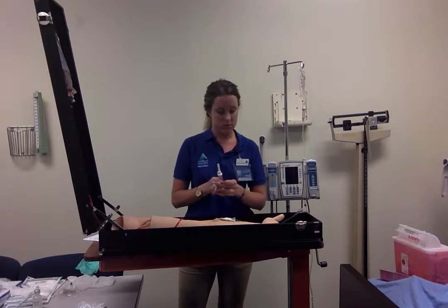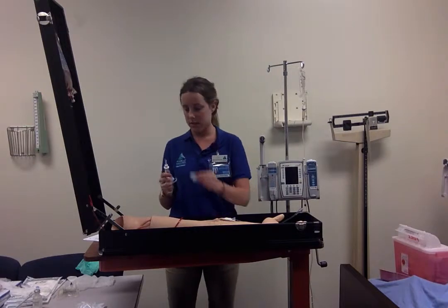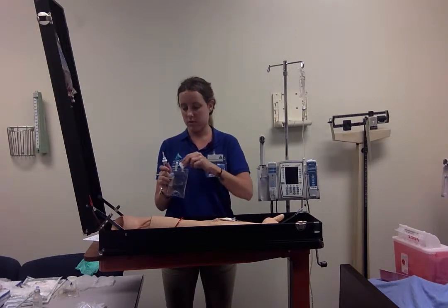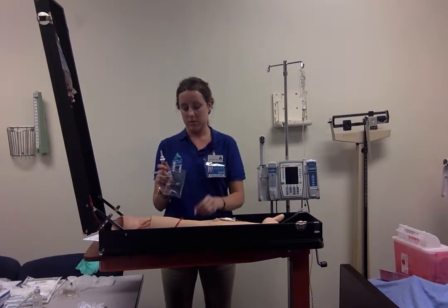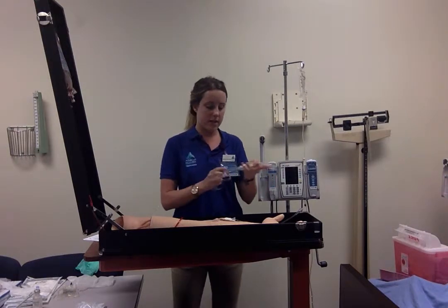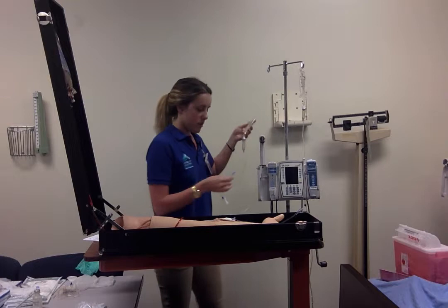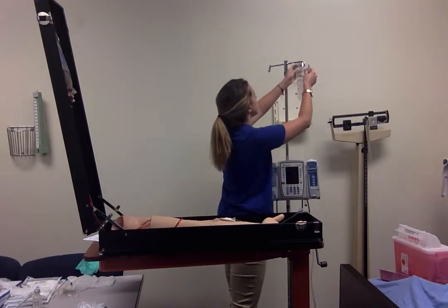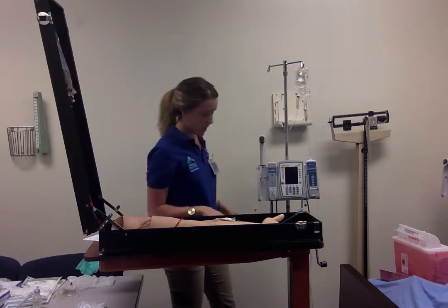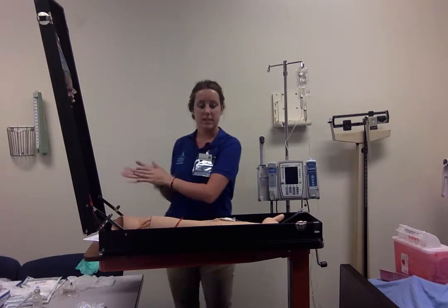I'm going to make sure that this port is clean, as well as this port. I'm going to connect the tubing. And I would now label this tubing so that anyone knows that I was the one that hooked this up. I'm going to get this situated up here. And before I unclamp this, I'm going to wash my hands and identify the patient.